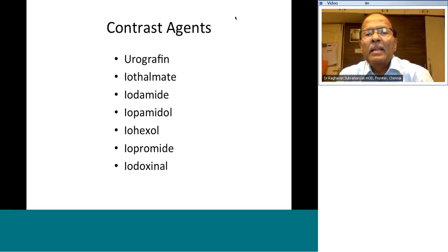Iohexol, yeah. Bharati said iohexol, very good. And I got one more answer, Vikas Gupta, iohexol. Yeah, now tell me why. Why did you choose iohexol? You are right, but tell me why. Non-ionic, very good, Bharati. Yes, I'm glad.